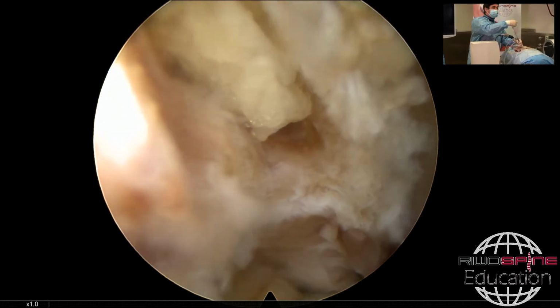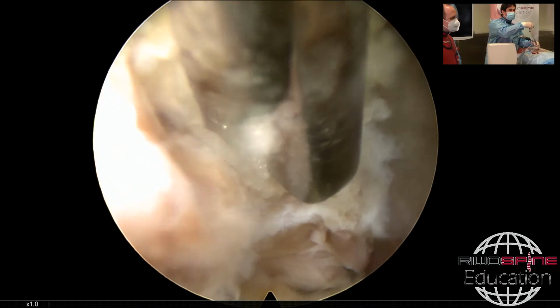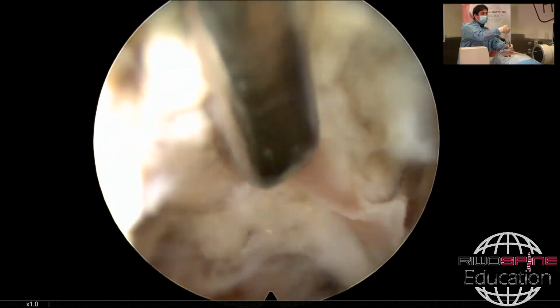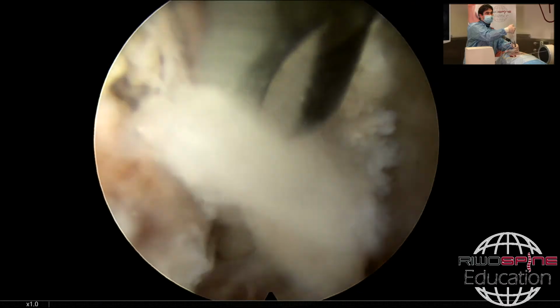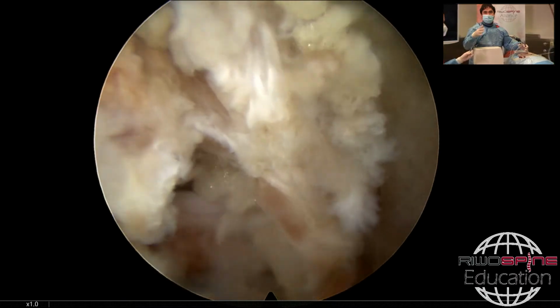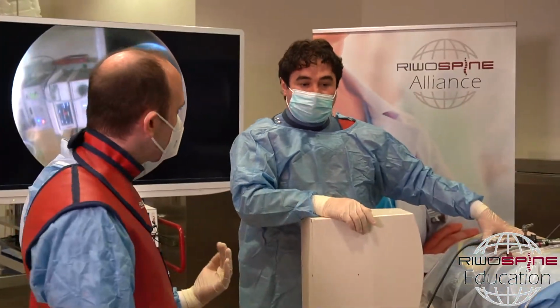Then we use the scissor like that again. The blunt part is in front, and we put it here, and we pull the ligament a little bit, and then cut it on the back side of the scissor. This design is really important. It's not exactly the same design as other scissors.